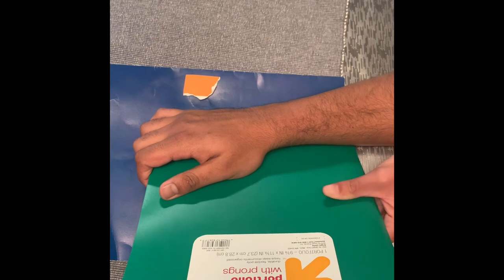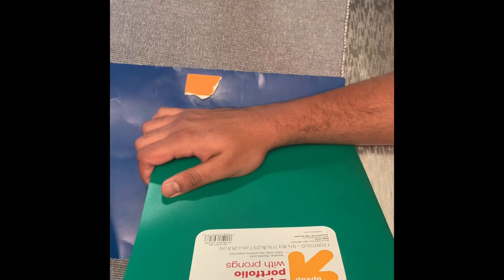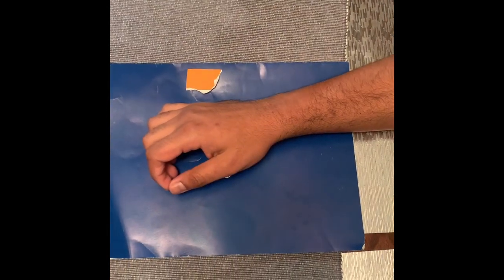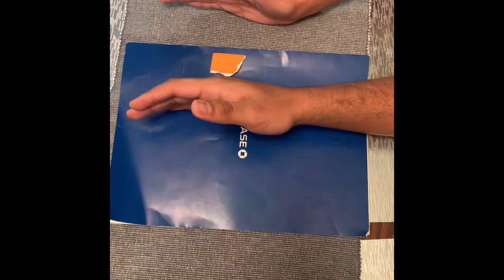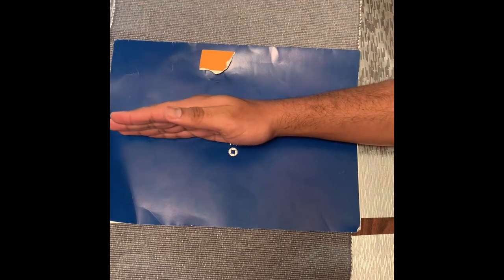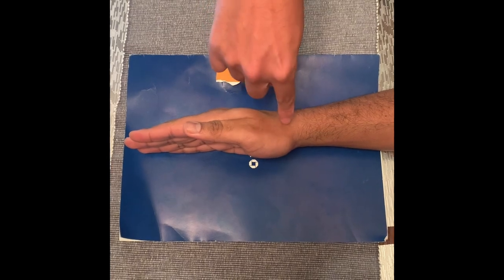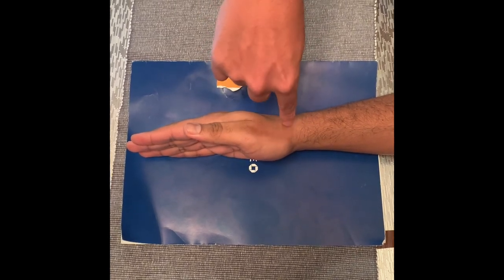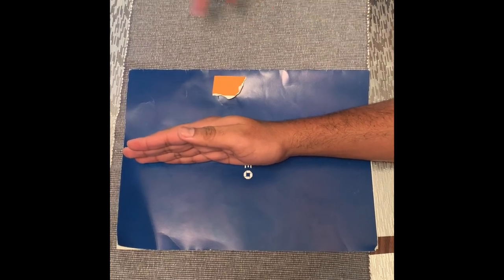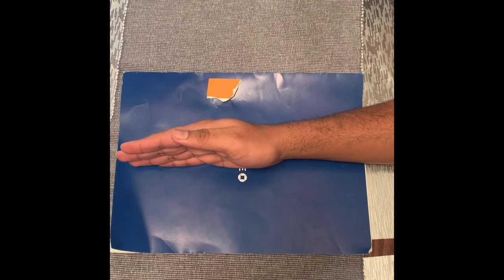The last of the standard views is going to be the lateral wrist. The patient is going to place their hand like this, with the finger right there. The central ray is going to be directed perpendicular to the wrist. The anatomy demonstrated is going to be the lateral projection of the carpals, proximal end of the metacarpals, and distal ends of the radius and ulna. Do not move — click — perfect.